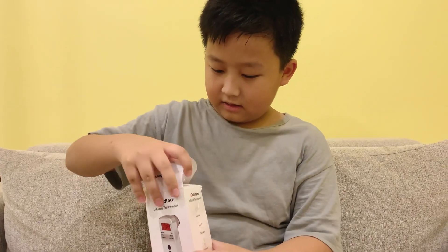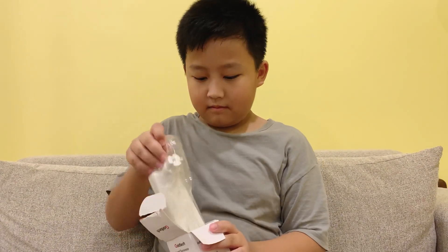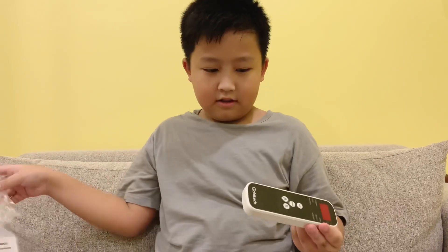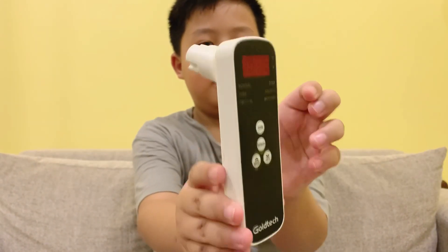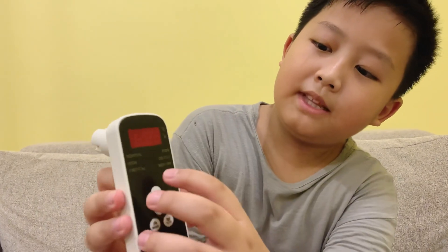Let's open it, shall we. That's how it looks like in the box — oh, it comes in this bag. Here, look. It only has one button on it — the scan button.